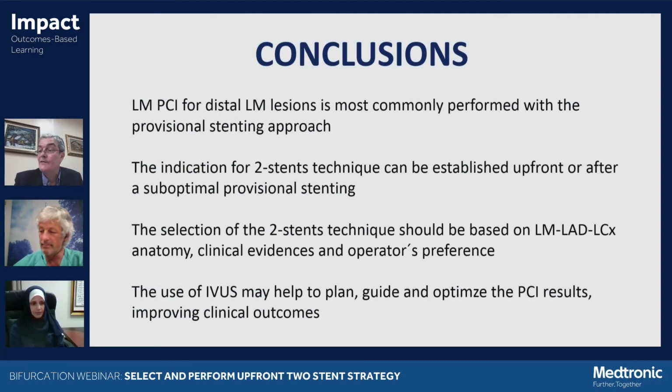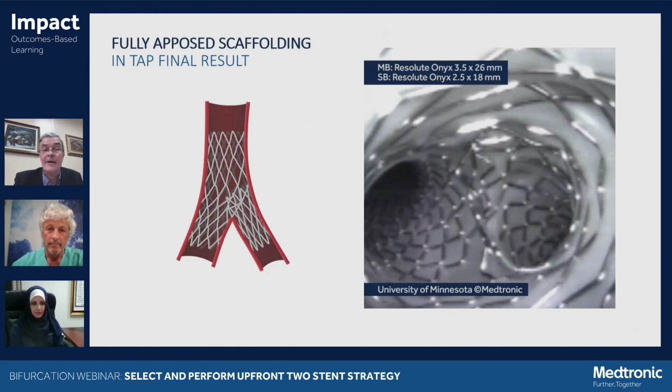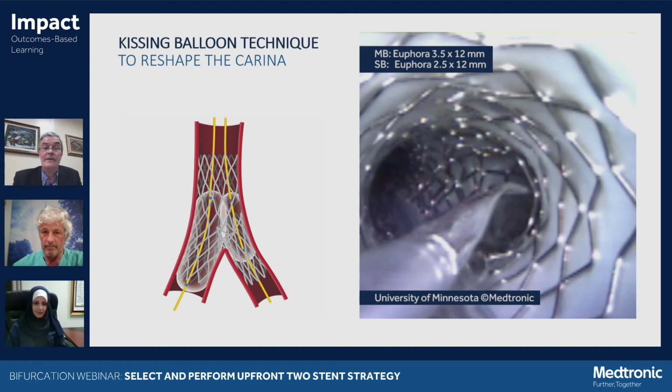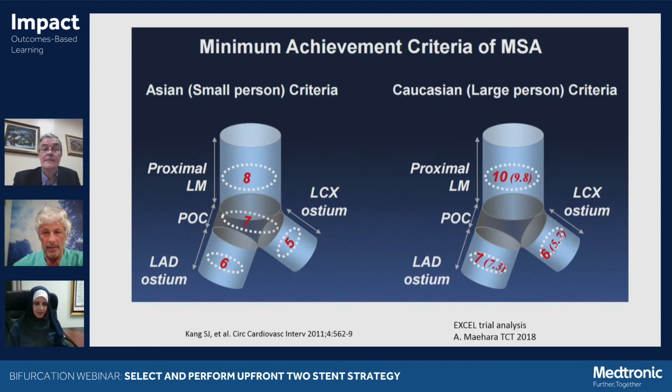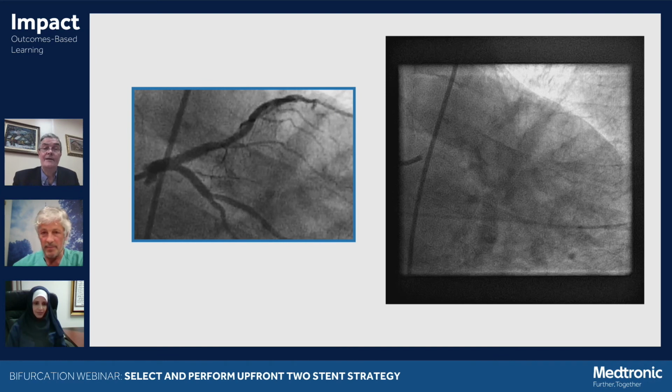Yeah, if we can have your slides back, people like very much the original image of the circumflex IVUS, and they would like to ask you, if possible, to recommend again on the plaque location in the left main and relation to risk of carina and plaque shift. I think it's very important because it's a privilege to have a real expert so we can learn how to interpret pullback from the circumflex. I'm trying to go back here. Yeah, slowly we are almost there. It's moving, it's moving.